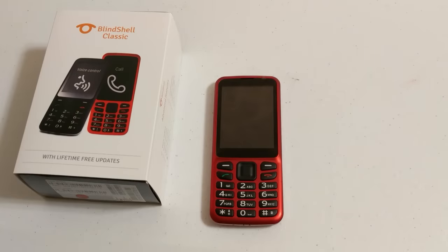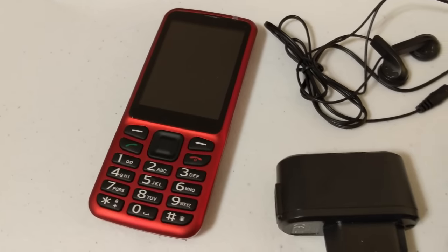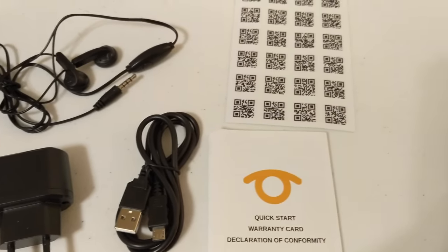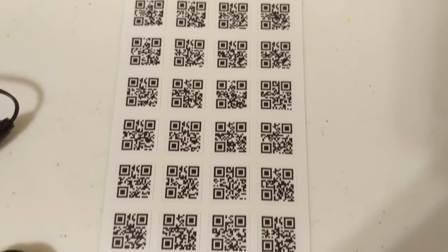Here's the phone, and thank you to Blindshell for sending me a phone to review. In the box it comes with a phone, a charger, a pair of headphones, a quick start guide, and some QR code stickers for the object tagging, which I'll explain a bit later on.